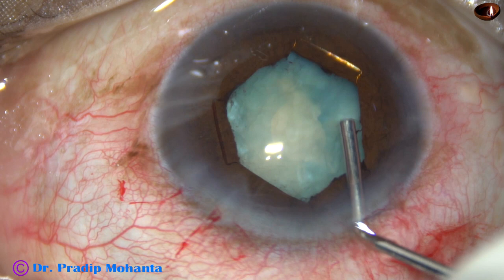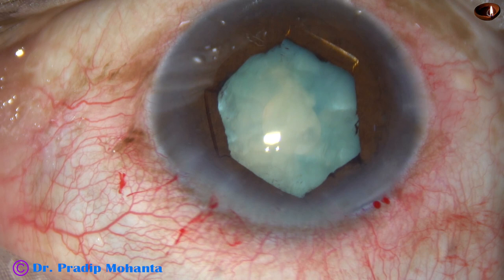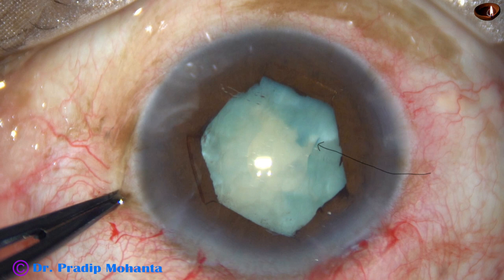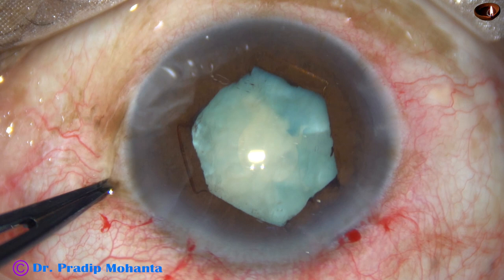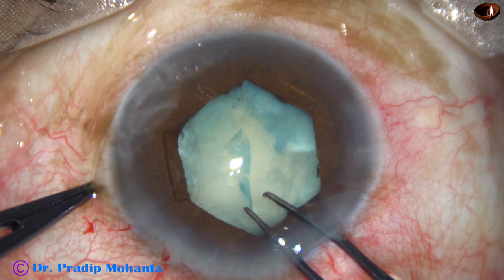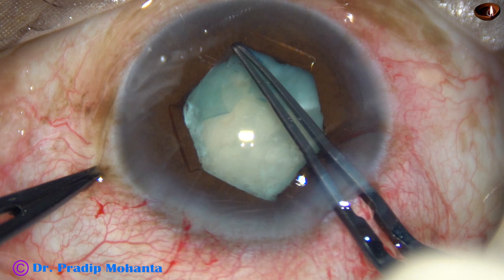Now I am going to take a Vannas scissor and make a nick at the margin of the pupil at around 7 o'clock. The flap is directed towards 10 o'clock, so we have to move this flap clockwise — to 10 o'clock, 11 o'clock, 12 o'clock — and complete the rhexis clockwise. Usually I go anticlockwise, but in this case we cannot go anticlockwise because the flap was directed that way.